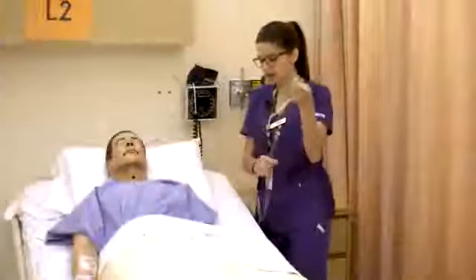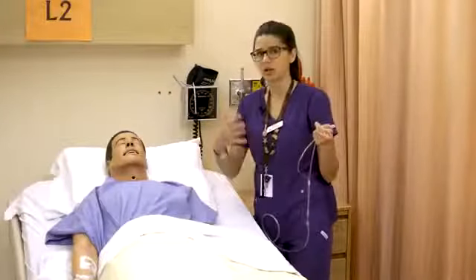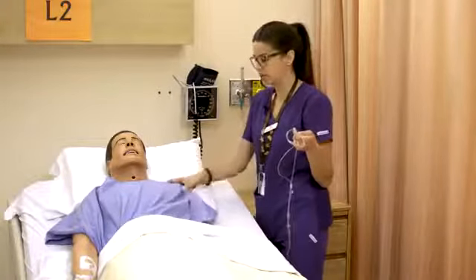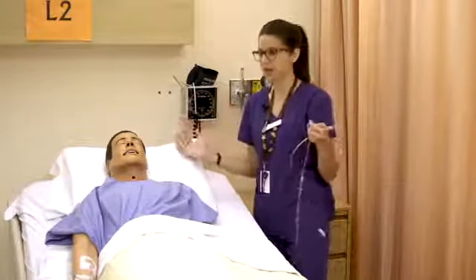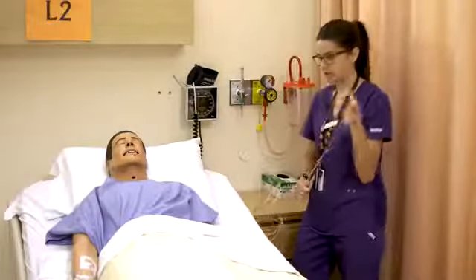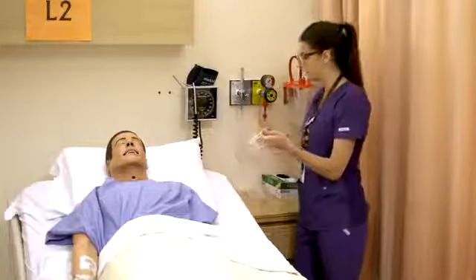And also, I think probably goes without saying, but if our patient did require oxygen, we would want to be monitoring their O2 sats, their respiratory rate, listening to their chest, doing our full chest assessment, and then also sitting them up, especially if they're having a hard time breathing. So just other things to note. But for now, we're focusing on the oxygen mechanism of delivery. So that's the basics with the nasal prong tubing.